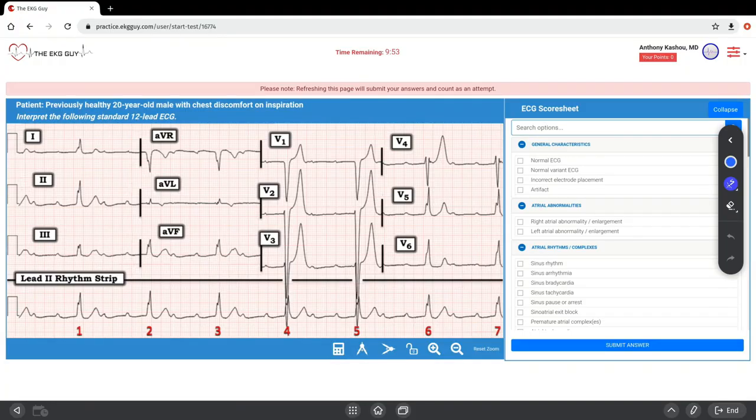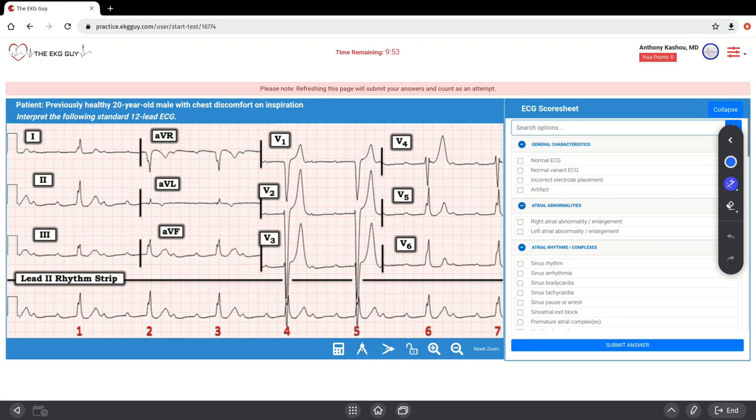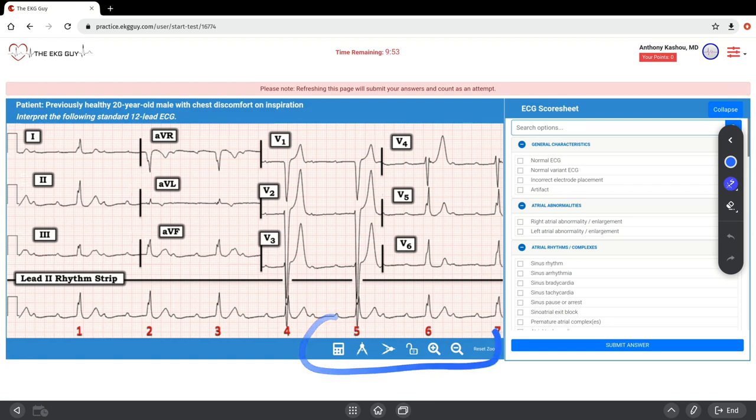To orient yourself when you log in, you'll see there's a time at the top that gives you 10 minutes for the ECG. Here's the patient clinical stem: previously healthy 20-year-old male with chest discomfort on inspiration. You have the 12-lead ECGs, different tools at the bottom including calipers, and here's the score sheet and coding options.